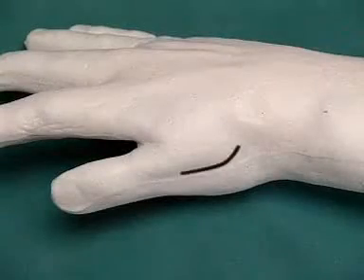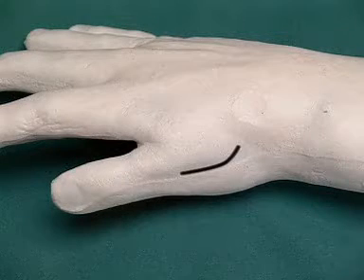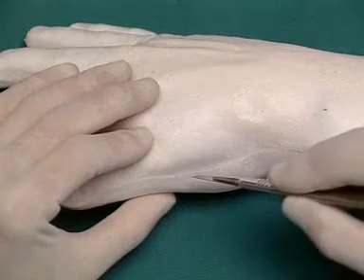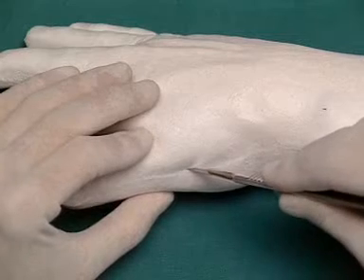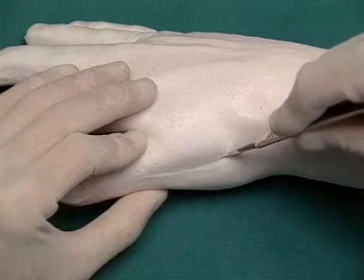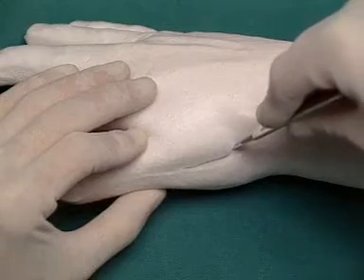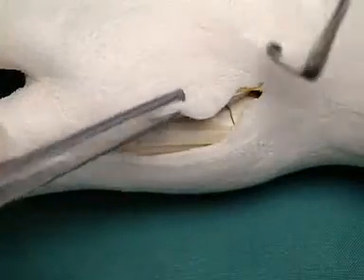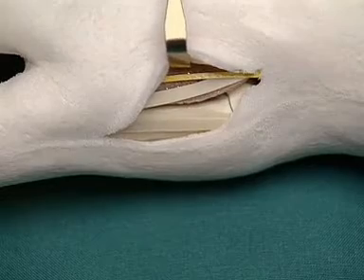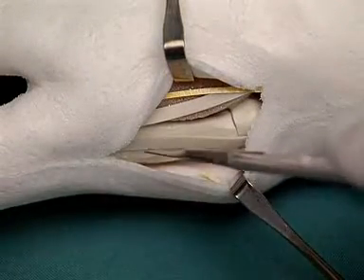The approach is marked on the model. The soft tissue is dissected longitudinally over the thumb metacarpal; proximally, the incision curves in an ulnar direction. After the soft tissue is retracted with blunt hooks, the approach to the metacarpal is made between the two extensor tendons of the thumb.